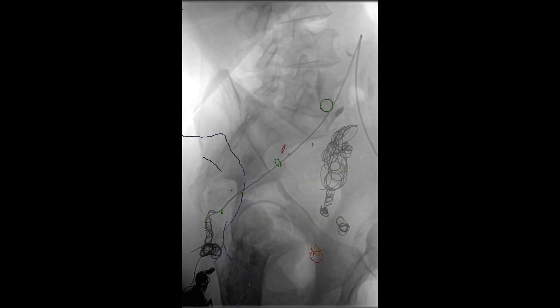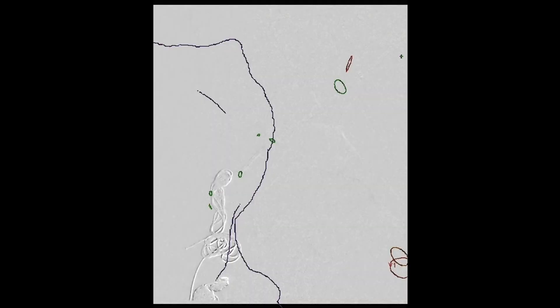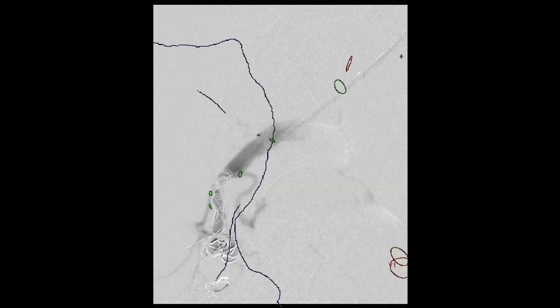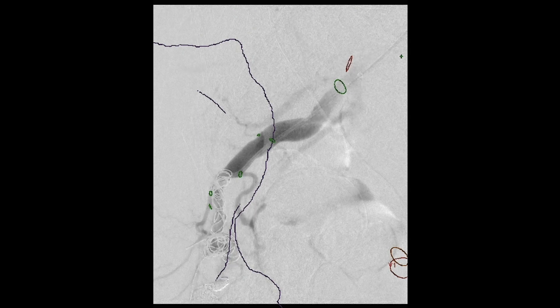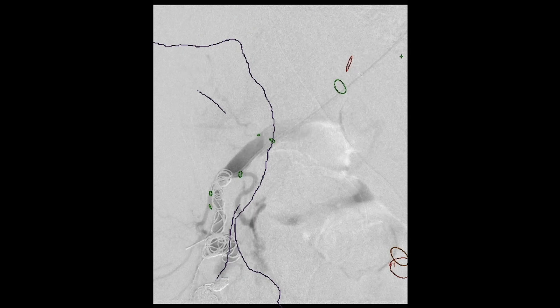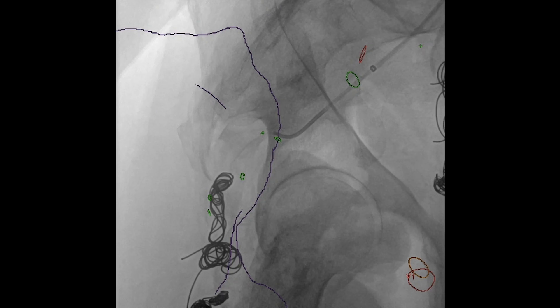It's fairly straightforward once you've spent the time doing this — you simply follow the dots and cannulate these branches. We embolized the first branch fairly extensively, but you can see all these little side branches are still perfused.